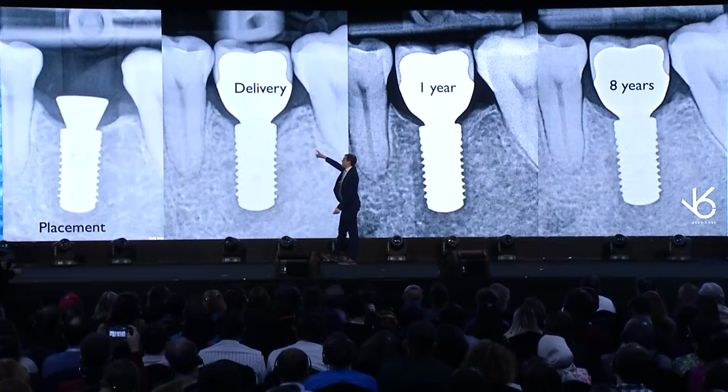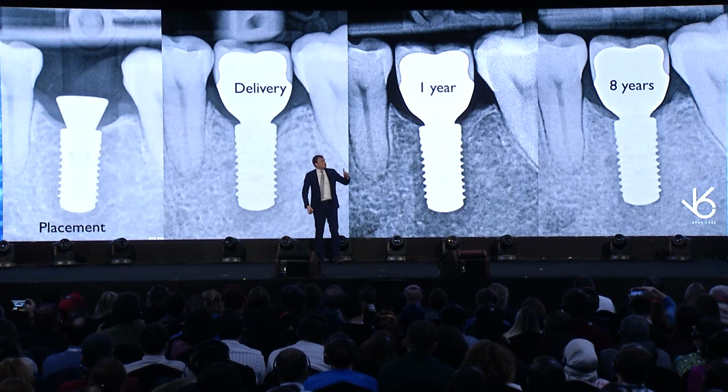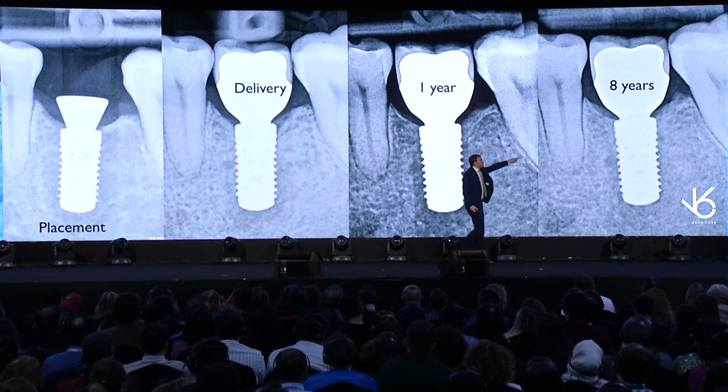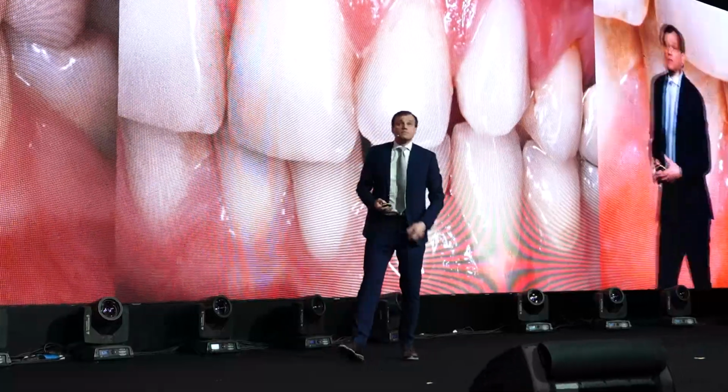Placement. At the delivery, I see some demineralization. Just 1 year is enough for the bone to come back, and after 8 years, I see bone getting better. Again, what bone loss? Forget about bone loss if you follow all these guidelines we talked about.